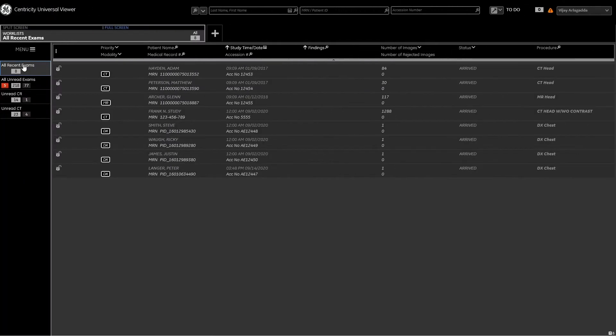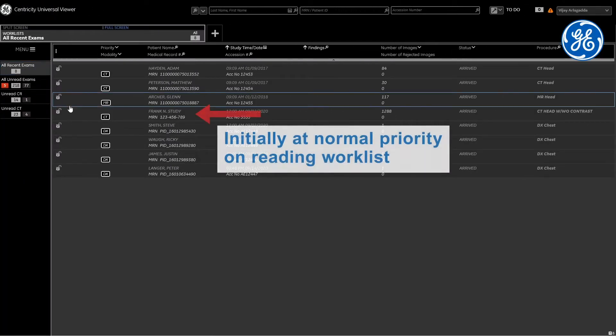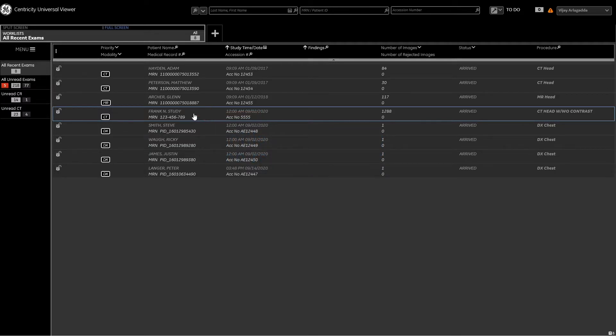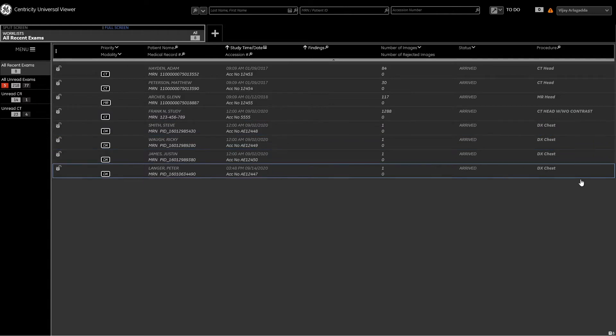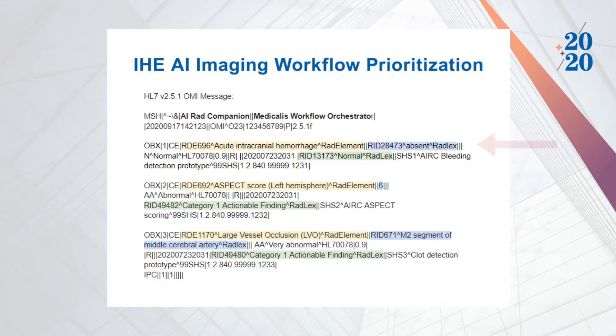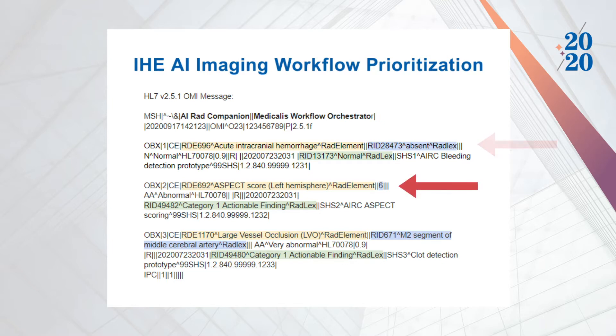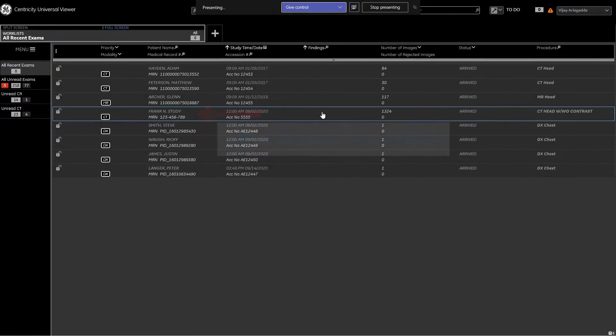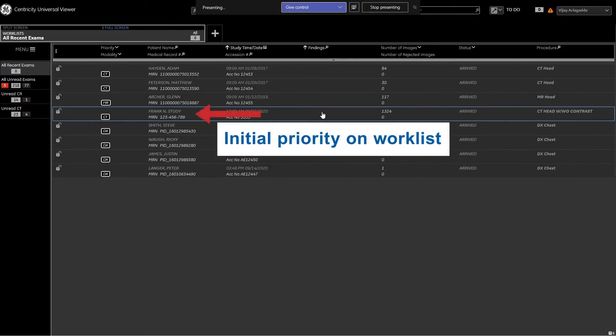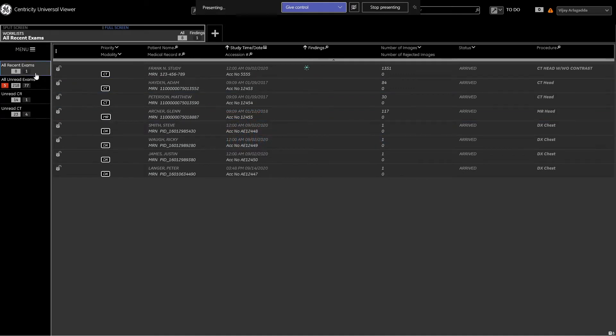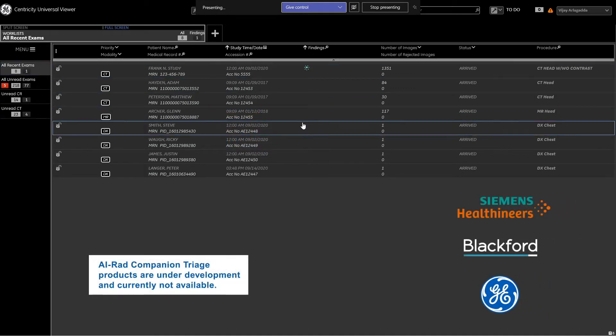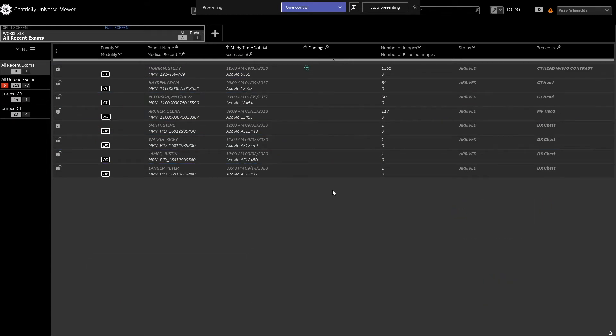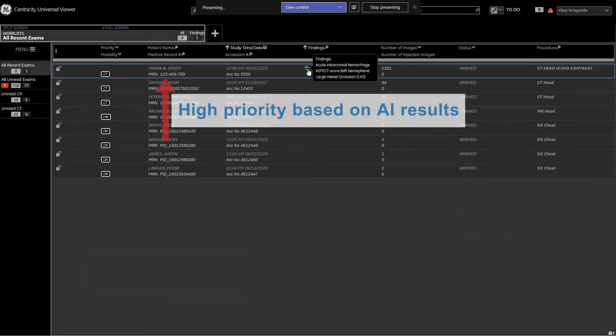As you can see on the GE Centricity PACS, our patient Franken study is listed on the work list in the order it was acquired. Initially, hemorrhage AI detection is performed on the non-contrast head CT. No hemorrhage is found, so an ASPECT score, a metric for determining severity of early ischemic changes in the brain, is calculated. Next, clot detection AI algorithm is run on the CTA series, which detects a large vessel occlusion. The Siemens Healthineers AI-RAD companion CT stroke algorithm sends the HL7 message to the Blackford analysis system, which then informs the GE PACS of the three main findings.